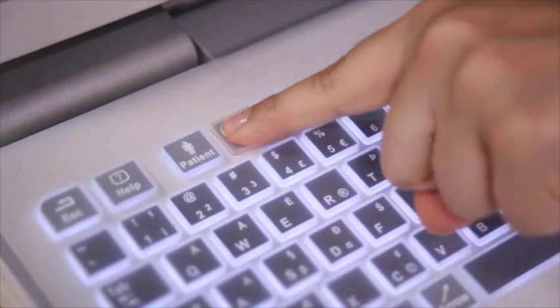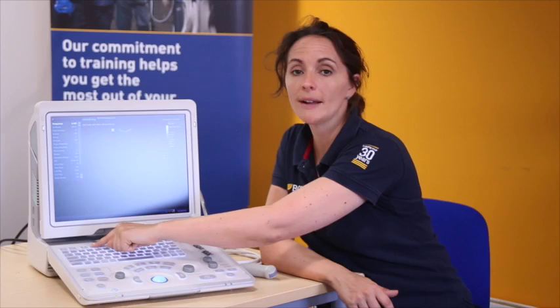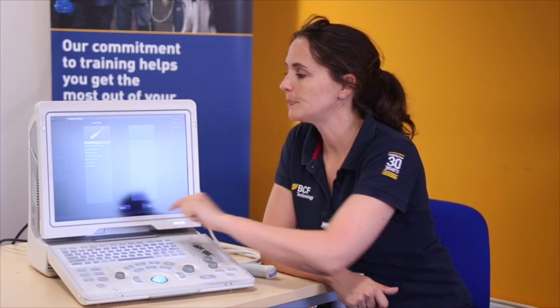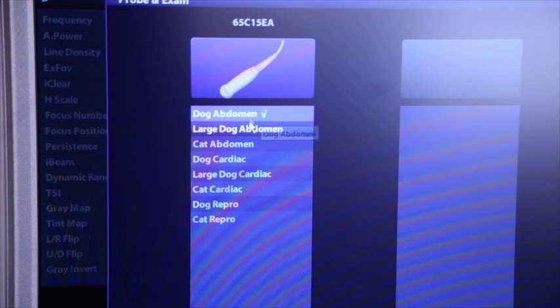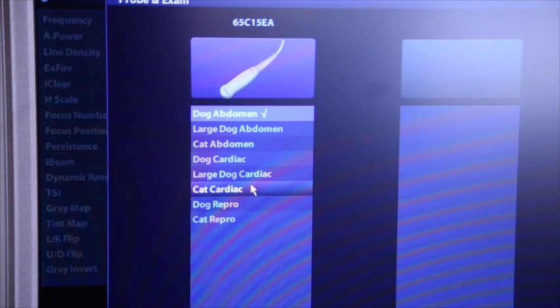To change your preset, you hit the probe button that is just to the right of the patient button that you just pressed. You'll see two columns, because at any one time two probes can be attached to a MINDRE.